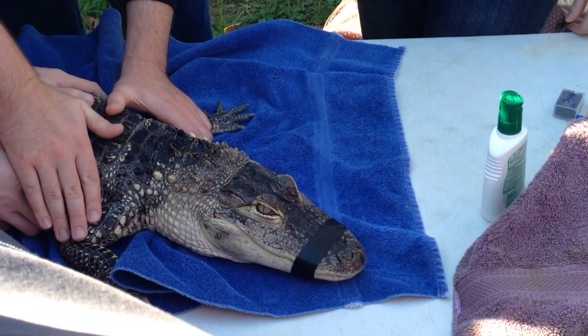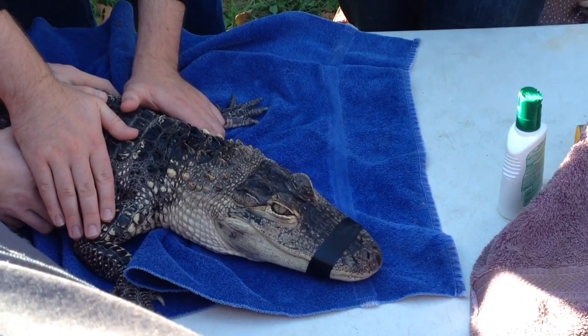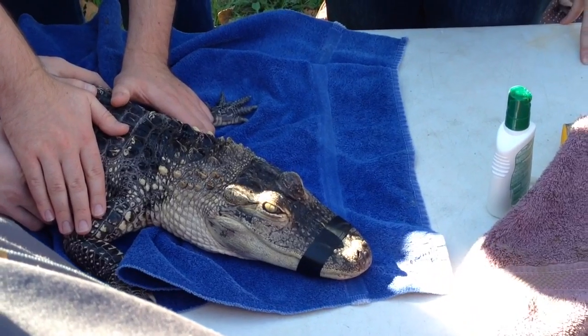Most of the animals do not bleed, but if we get a little bit of blood, don't worry about it. And then the first thing when we get done and you take it out, I'm going to grab the needle away from you.